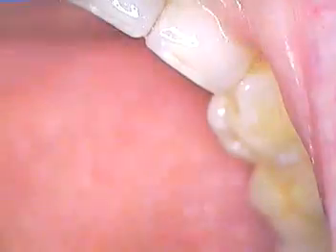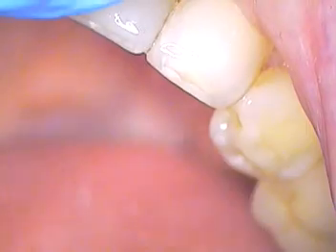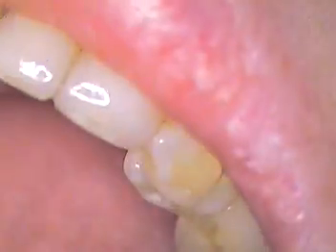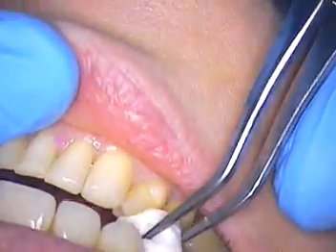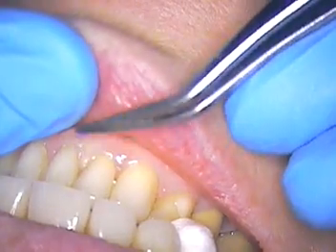This is our little chimney — you can make them yourself. All it is is a piece of cotton roll with a hollow end to it. Go ahead and close on that gently, close, continue to close, put that together. Open, place, close again, stay together. We'll let it go five minutes — see you back on the next segment.